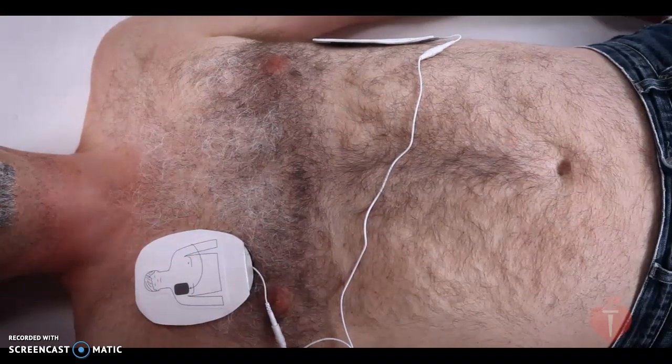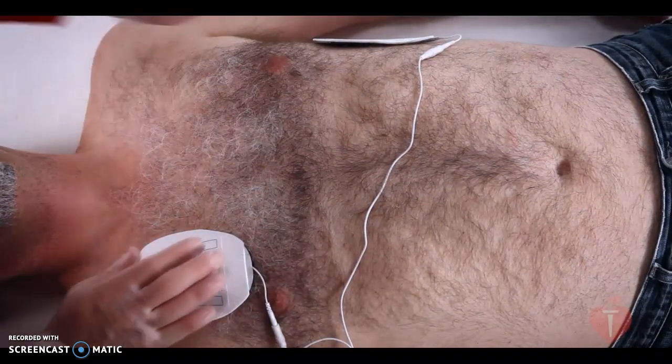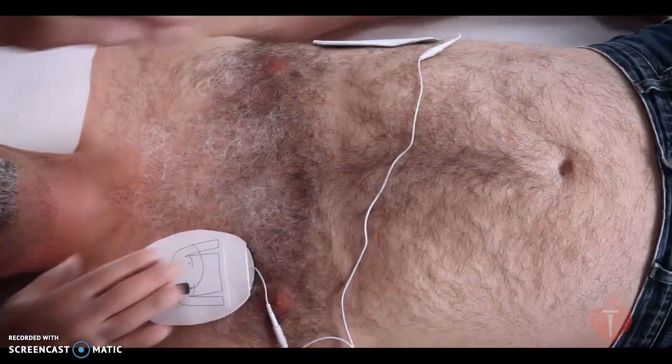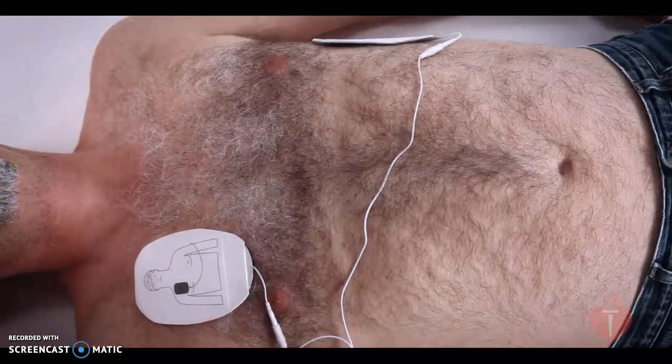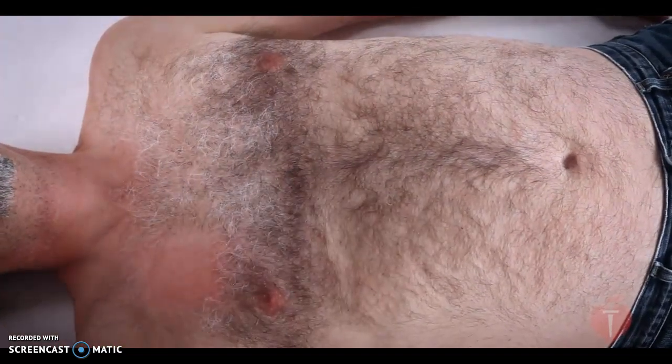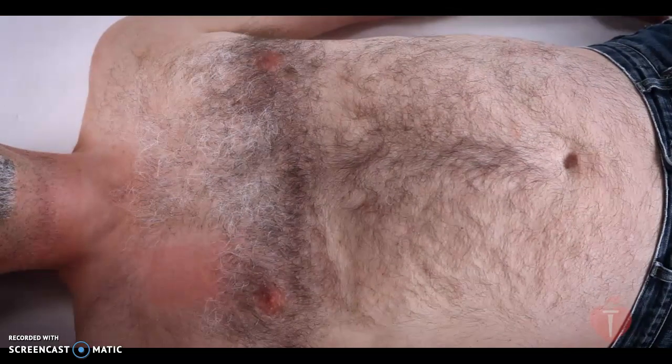If the hair prevents the pads from coming in contact with the chest, the AED should tell you to check the pads. If it does, press the pads down more firmly. If they still aren't sticking, rip the pads off forcefully, removing the chest hair. Then reapply a new set of pads to the bare skin.